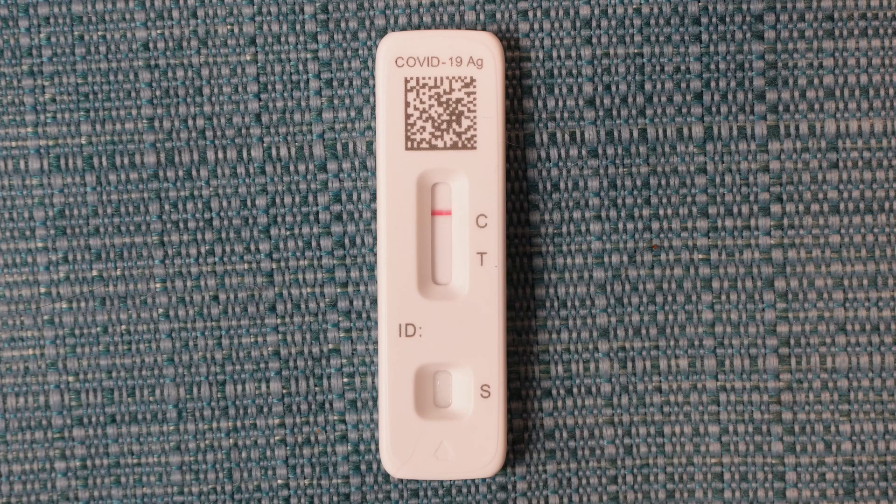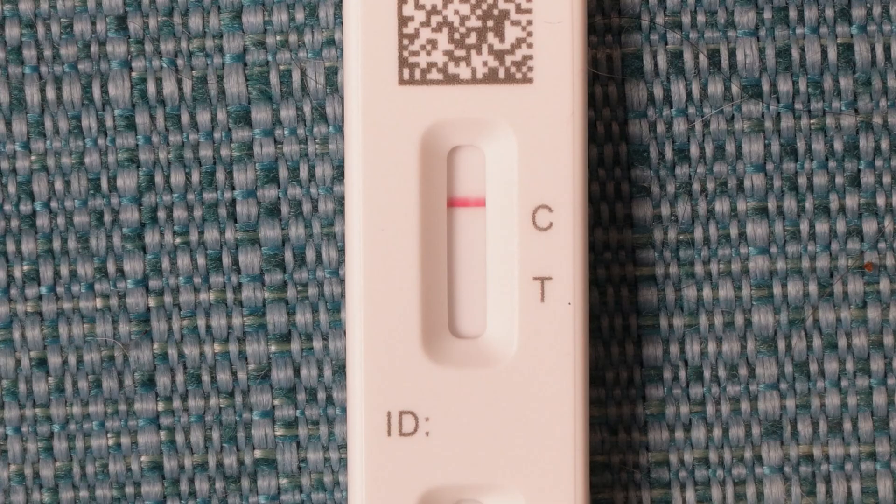There are two possible lines that will appear: one beside the C and one beside the T. If you only get the one beside the C, then the test did not detect COVID in your sample. The instructions recommend that you test again within 48 hours if this occurs. If two lines appear, then the test did detect COVID in your sample, and it says you do not need to test again to confirm.